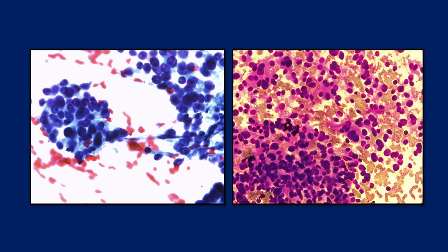You could find some areas of calcification here, maybe a little bit here. So this happened to be, I think you guessed it, a pilomatricoma, all right? Calcifying epithelioma of Malherbe. Not going to go too much into the details of that. Let's look at this one now.